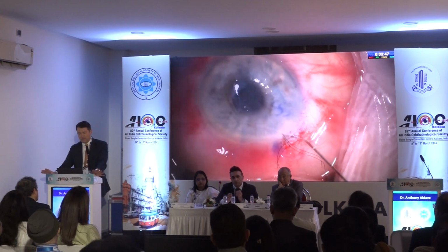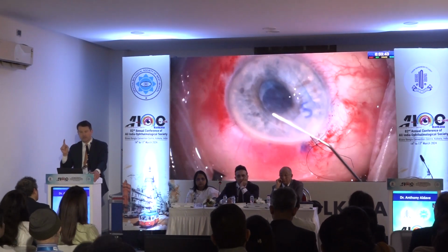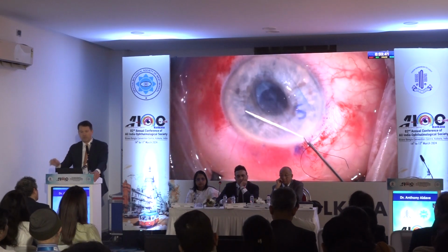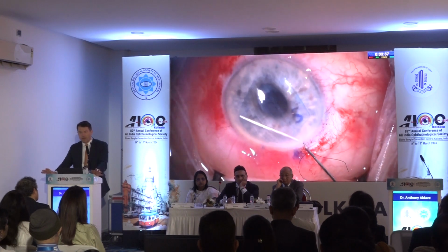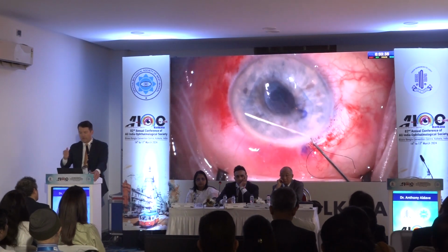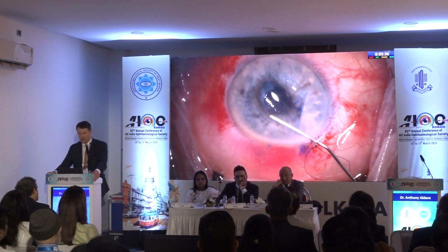Now I've got this side unfolded. I'm going to do the same technique you saw in the prior video with that cannula, the direct manipulation technique. Going to push this other side unfold. So in this case, I've unfolded the graft without the normal tapping technique. One side I aspirated, the other side I pushed with the cannula, and lo and behold, got this graft unfolded.